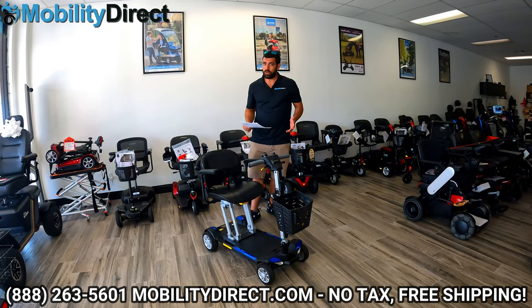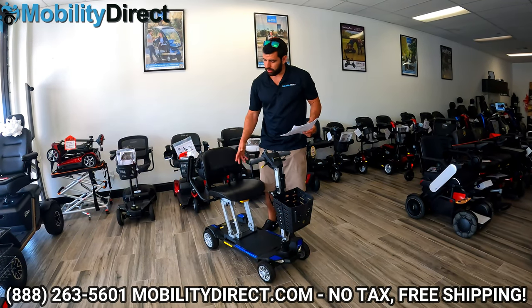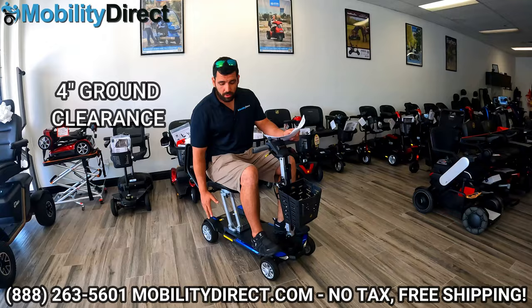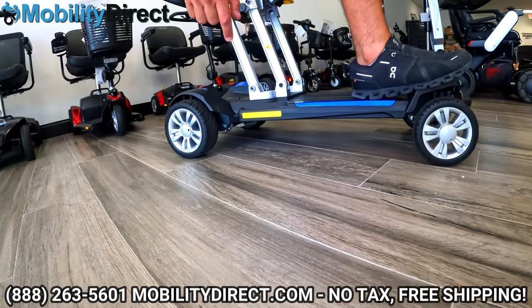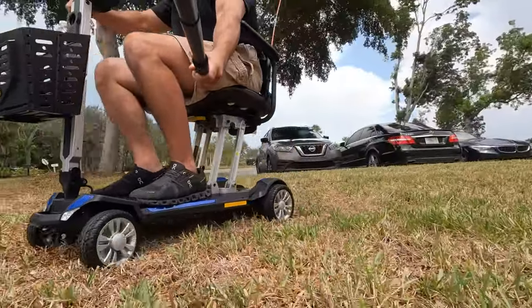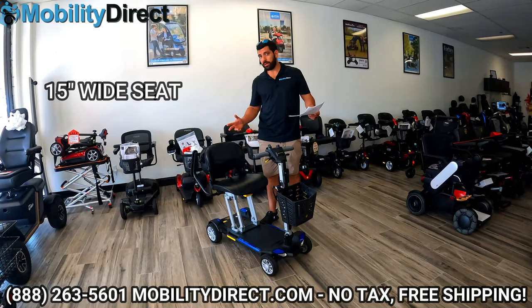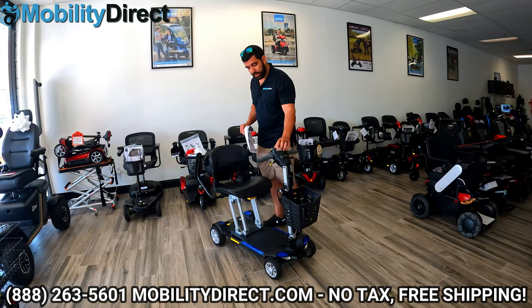Some of the really important specs are that it can hold up to 300 pounds. It has flip-up armrests, so you can flip them up and out of the way when you get in and out of the chair. It has a four-inch ground clearance, so when you're going on grass, there's plenty of clearance between the bottom of the deck and the floor — it performs pretty well on grass. It has six-inch tires in the front, seven-inch tires in the rear. The seat is 15 inches wide and very comfortable for a folding scooter. It also has a light kit.